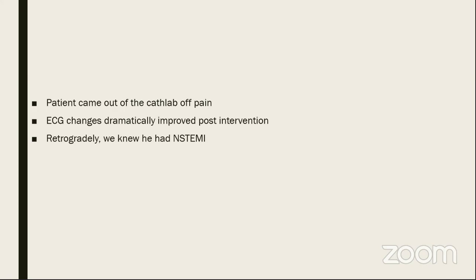The patient came out from the cath lab free of pain. The ECG changed dramatically, improved post-intervention. Retrospectively, we knew that he had non-STEMI after the biomarkers that were withdrawn at baseline before entering the cath lab showed up the results. He was discharged from the hospital in 2 days.